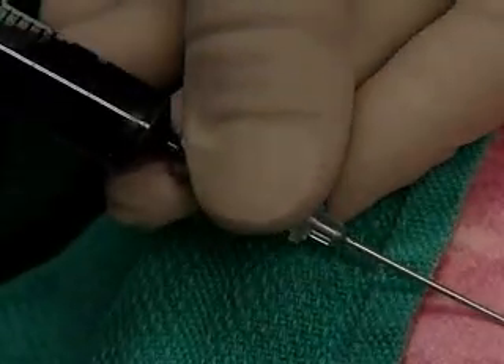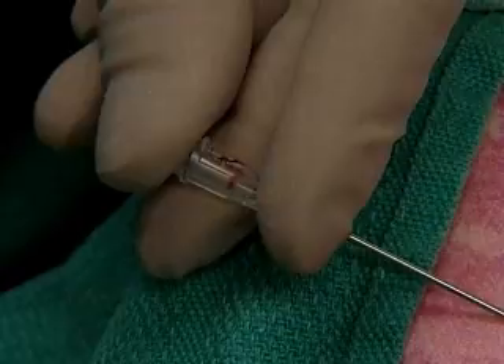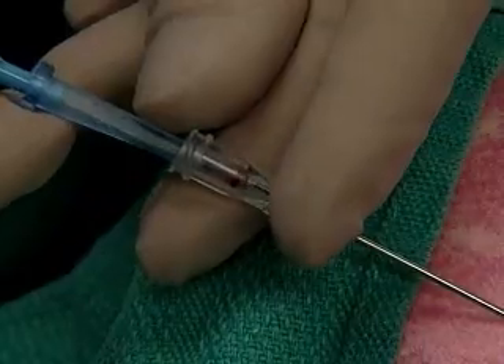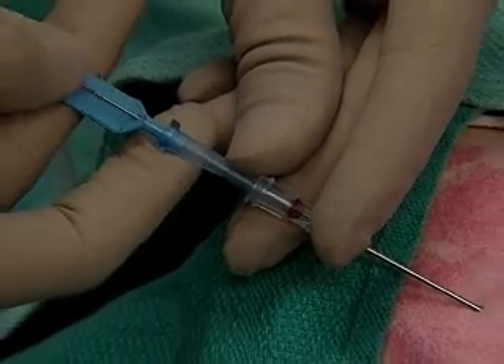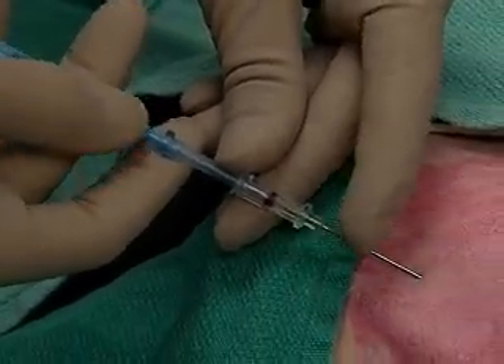Hold the needle securely, remove the syringe, and start feeding the wire. That 20 centimetre mark disappears into the needle, and we'll go just past that point.